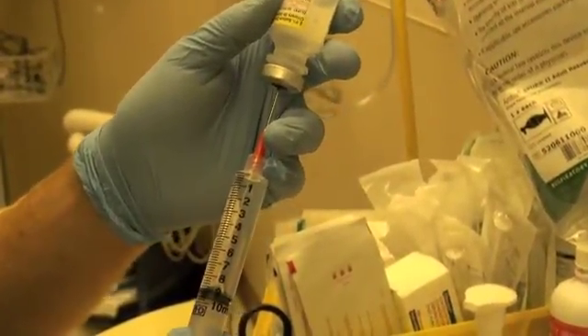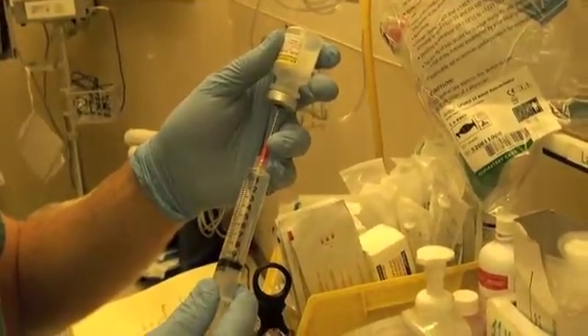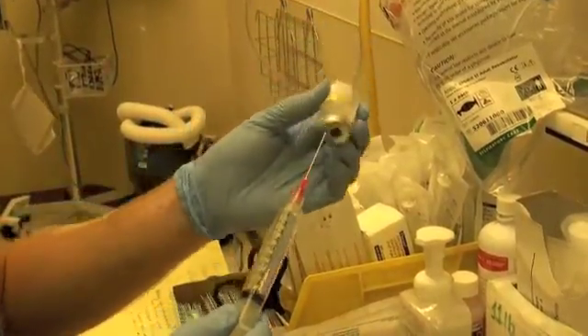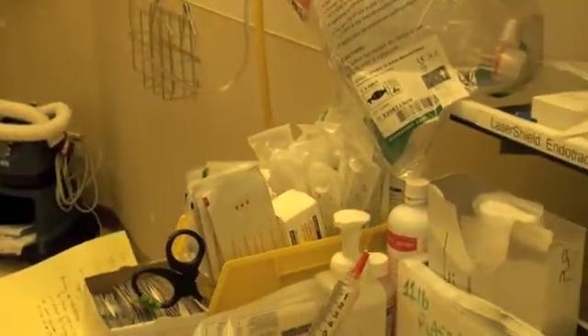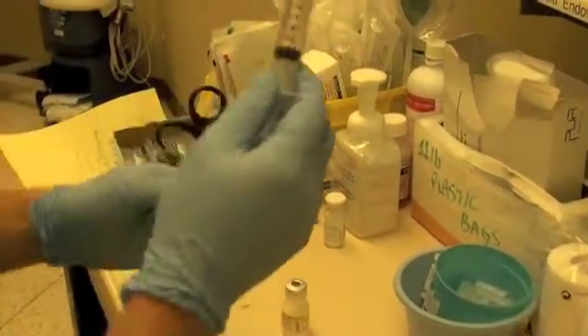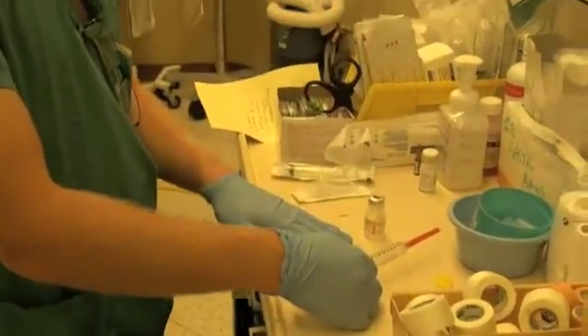Eventually you're going to pull the needle back to the bottom of the vial, and we should be right at about 10 milliliters. If you're finished with this, you'd cap the needle, label it, and then store it until you're using it.